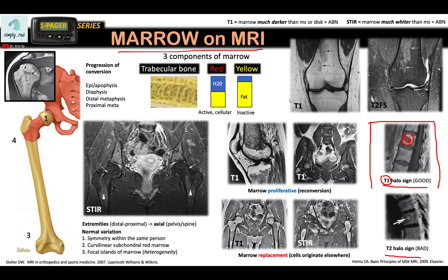In the T2 halo sign, you have a central hypo-intense lesion surrounded by a periphery of hyper-intense signal. The hyper-intense signal is suggestive of active disease or presence of edema. Hence, this is a bad sign.